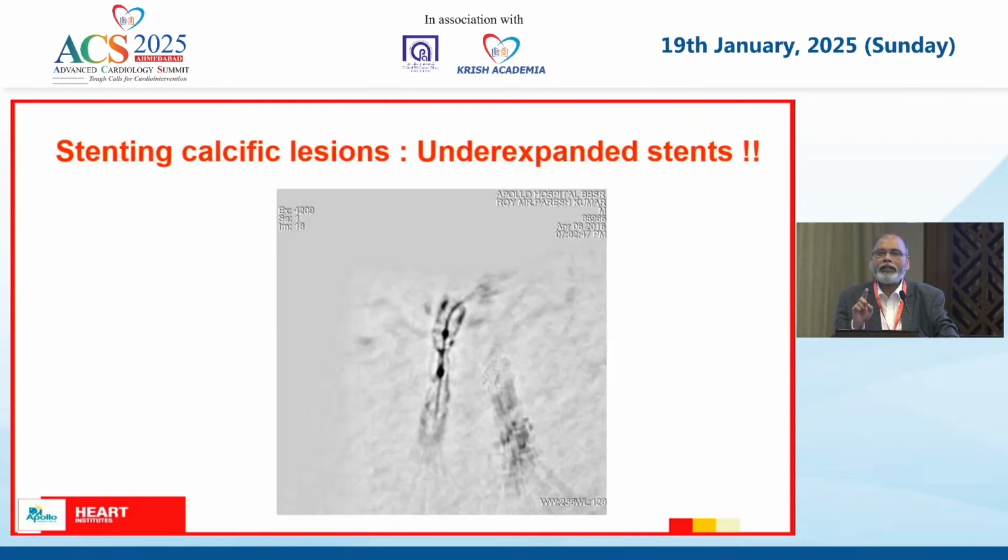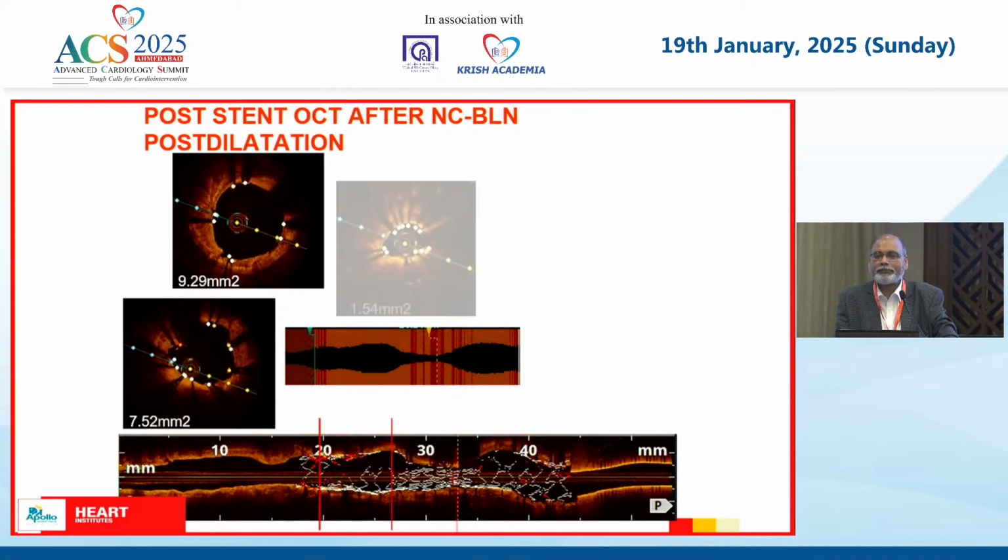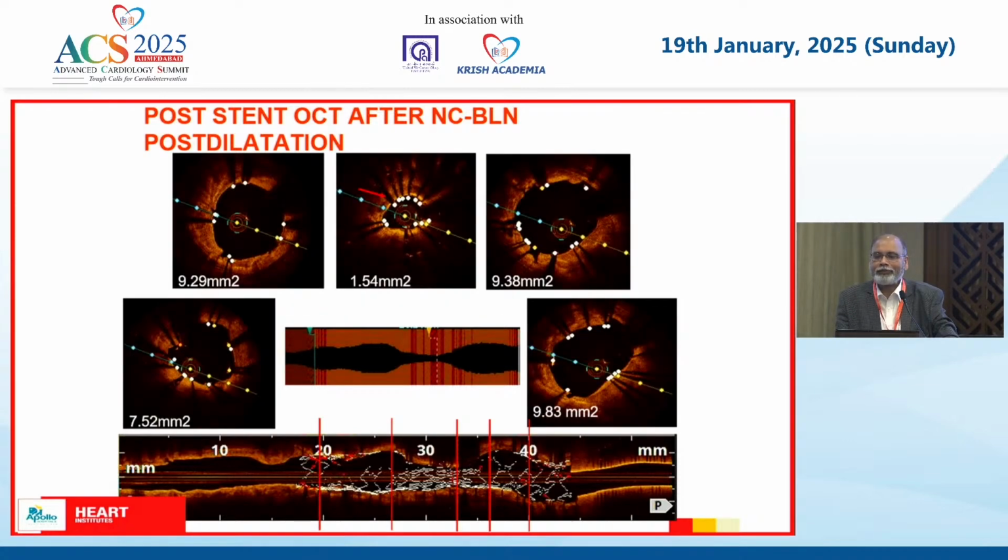Now, a very problematic thing is when we do not prepare the bed and we just go ahead and do a stenting. This is what happens. Now, if you see this, the stent has been given, and this was done by one of my registrars. In fact, he did it. He thought it's a cakewalk, and you see what has happened over here at the red arrow. Still, the stent is not opened up.